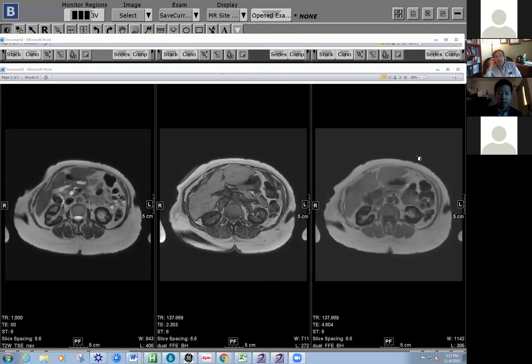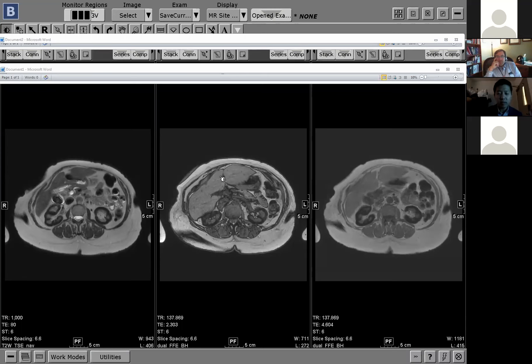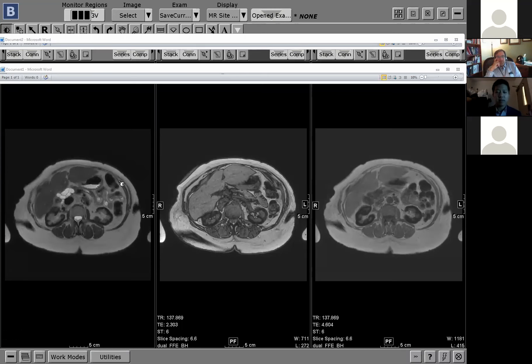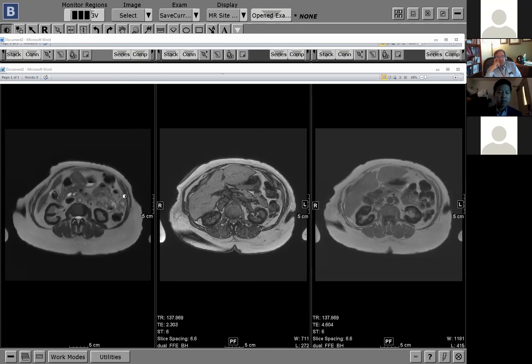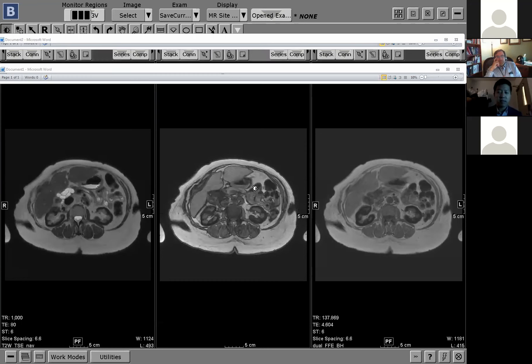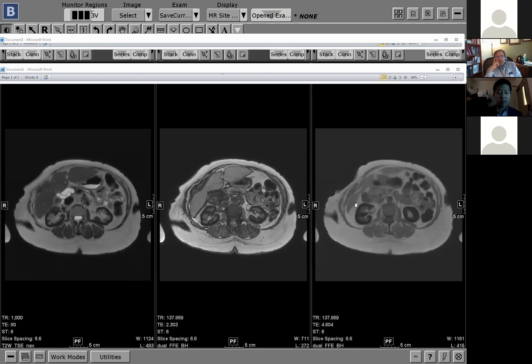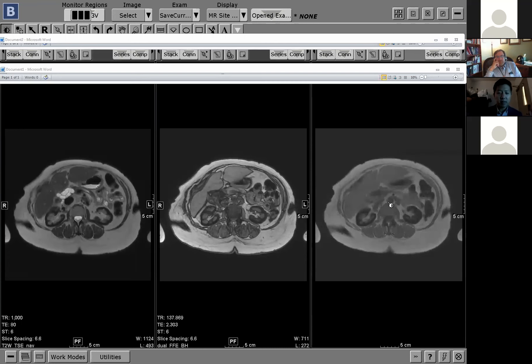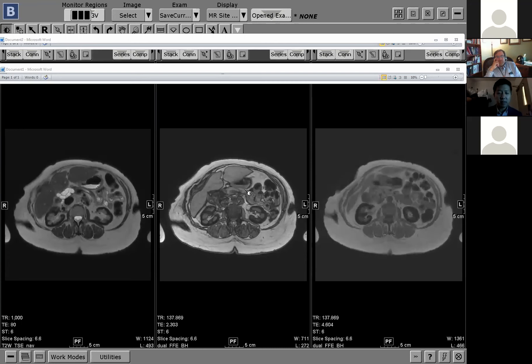Just a couple of cool diagnoses — one gray call and one subtle miss. This first case is interesting because it's an indication — a cause for this entity — that I had never realized until this case.